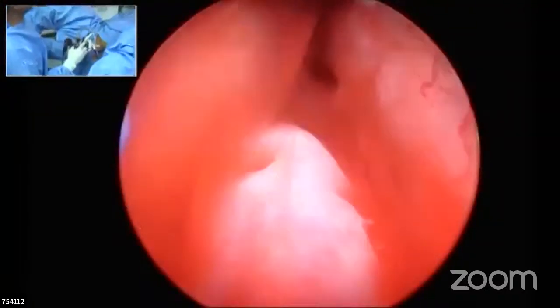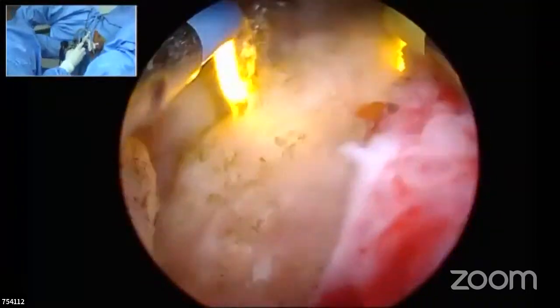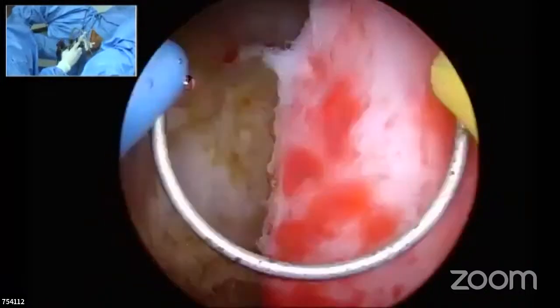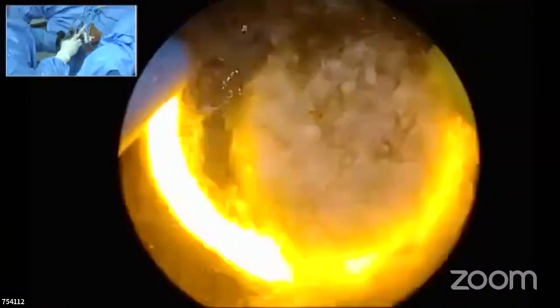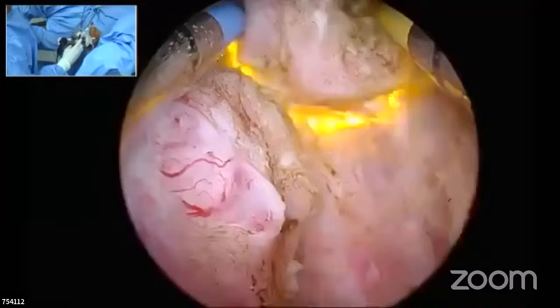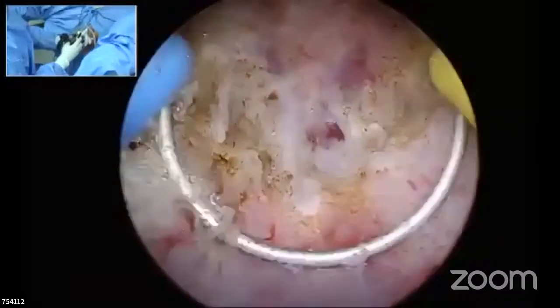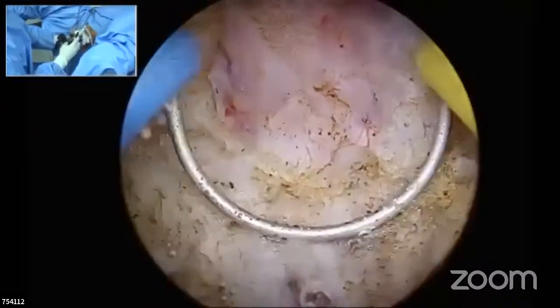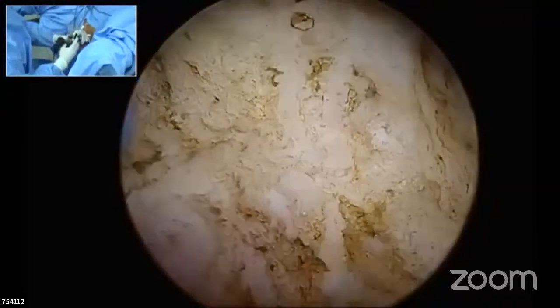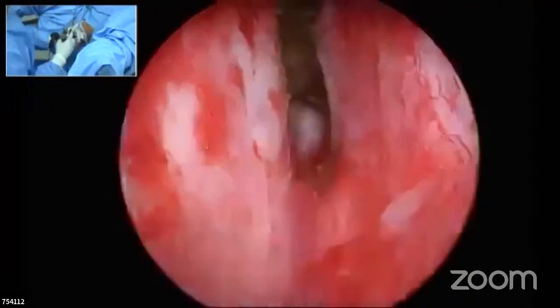So having completed the median lobe, are there some questions? Yes, sir. Do you ask your anesthetist to lower the blood pressure? I don't for routine cases, possibly for a case which is around 150 or 170 grams, in which case I may think about asking them to do a mild hypotensive anesthesia for some period of time. And once I start coagulating towards the peripheral part, I'll ask them to stop that hypotensive anesthesia so that I can do hemostasis. So this patient's blood pressure is normal now. No, this patient's blood pressure is around 128 by 72.